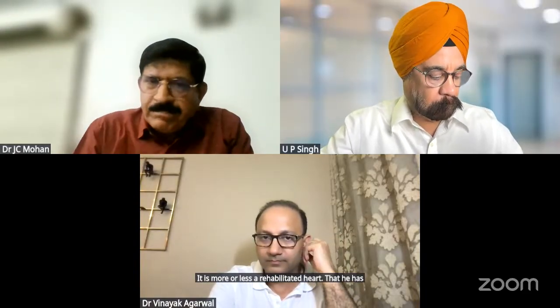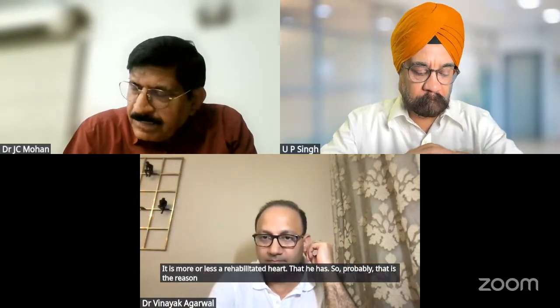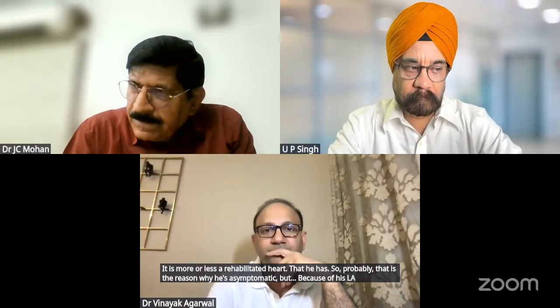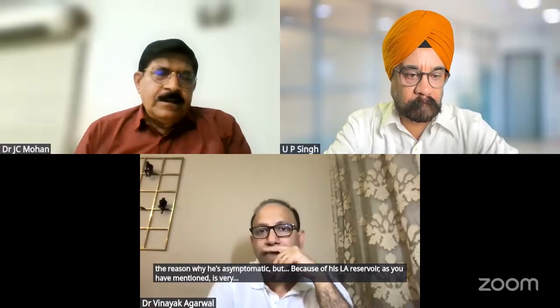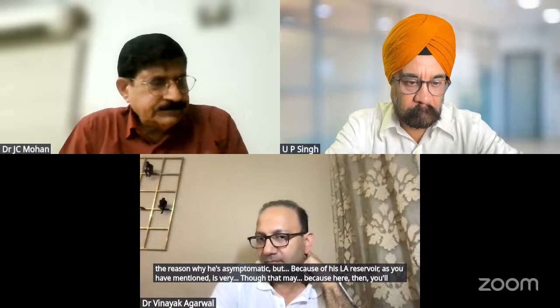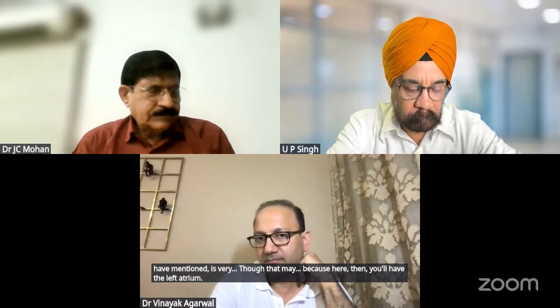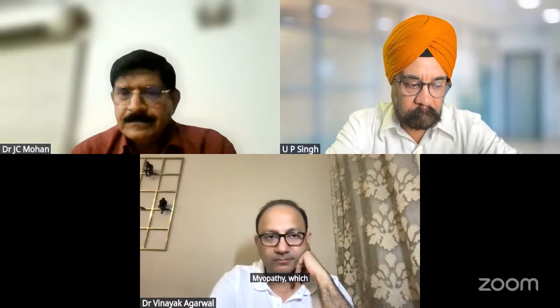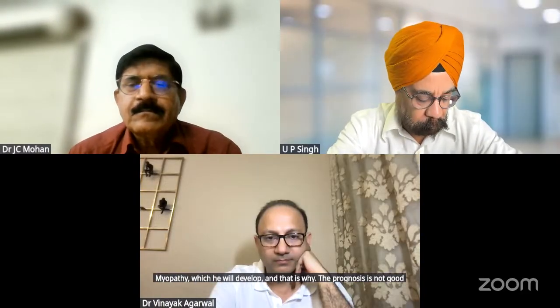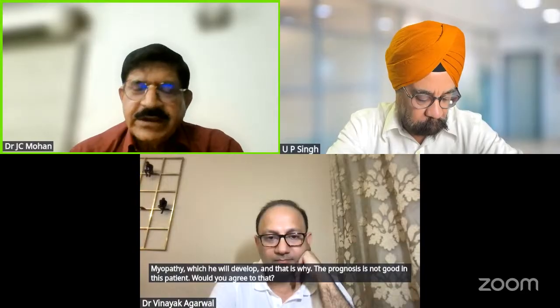So probably that is the reason why he's asymptomatic, but because his LA reservoir, as you have mentioned, is very low, he will develop left atrial myopathy, and that is why the prognosis is not good in this patient. Would you agree to that? Yeah, I would agree to that.